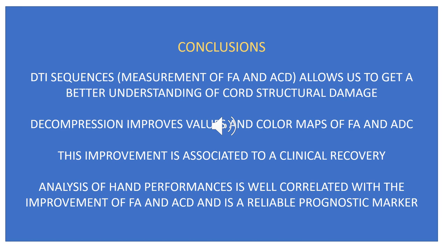In conclusion, DTI sequences, measurement of fractional anisotropy and ADC, but also many other parameters, allow us to get a better understanding of cord structural damage. The decompression improves values and color maps of FA and ADC. This improvement is associated to clinical recovery.